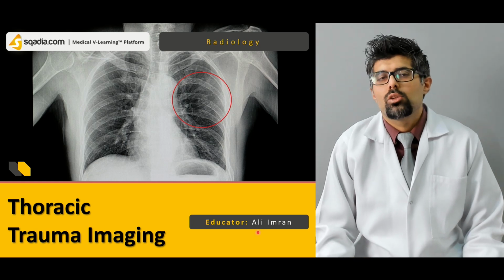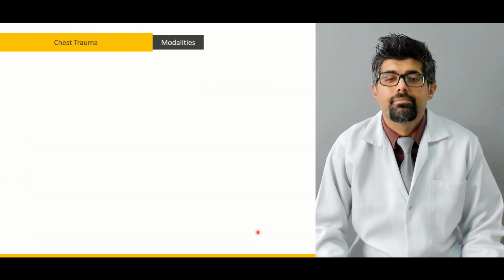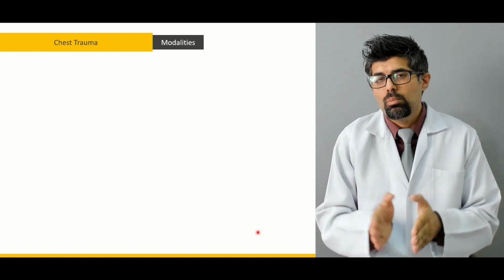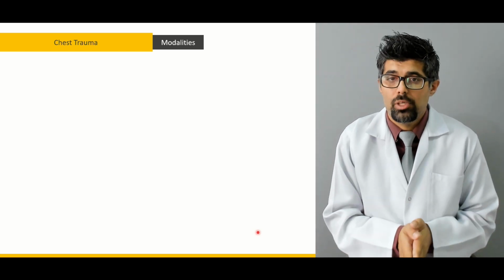Today's lecture is on thoracic trauma imaging. So let's start with it. In this lecture, both thoracic cavity and chest, these terms will be used interchangeably.